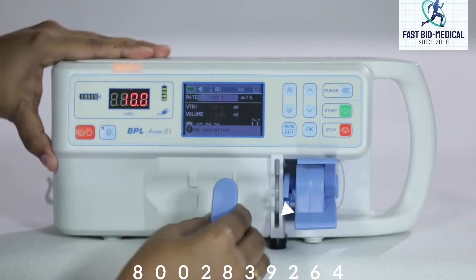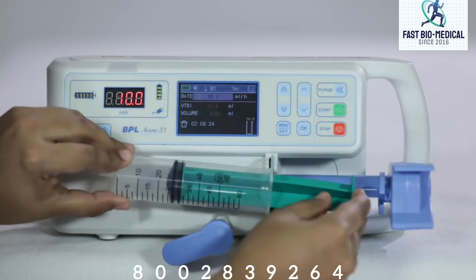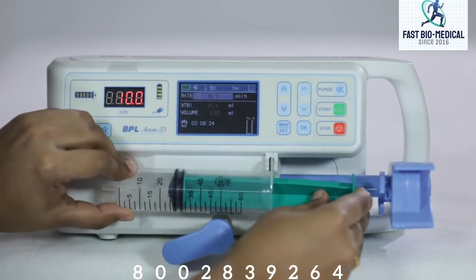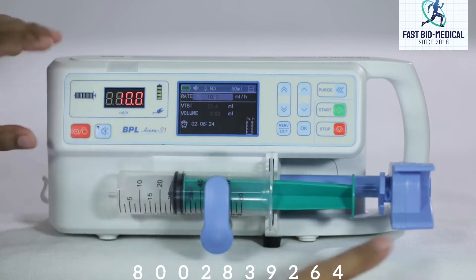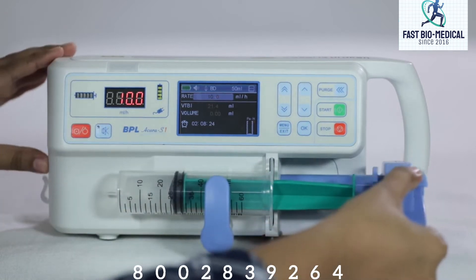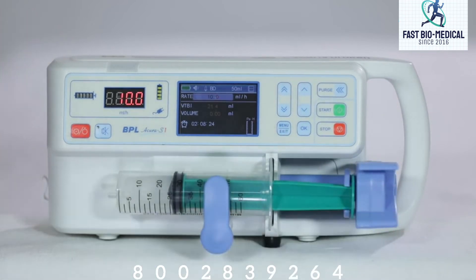Pull out the syringe clamp and turn it counter-clockwise by 90 degrees. Place the syringe in its cradle and the flanges correctly into the provided slot. Turn the syringe clamp clockwise by 90 degrees and press it to secure the syringe. Press the finger grips and slide the mechanism to the left until it reaches the plunger head, then release the finger grips to make sure the plunger grippers are holding the plunger in place.